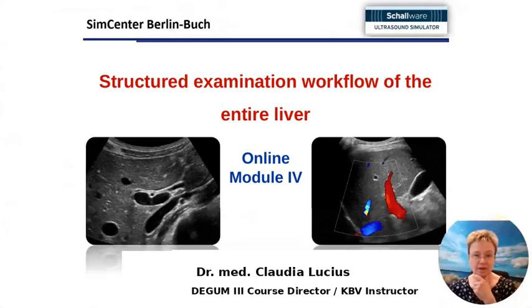Yes, last but not least, part 4 of our preparation videos. From the large block of liver sonography, we have compiled the information that should enable you to develop a structured examination procedure for the entire 3D organ, the liver.